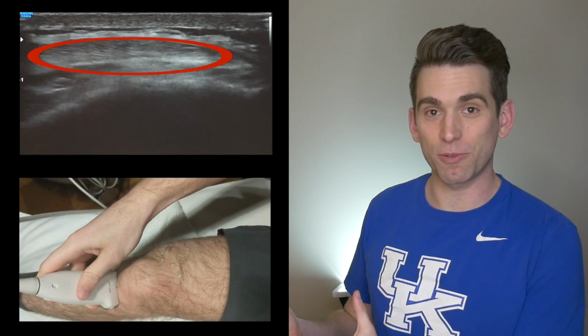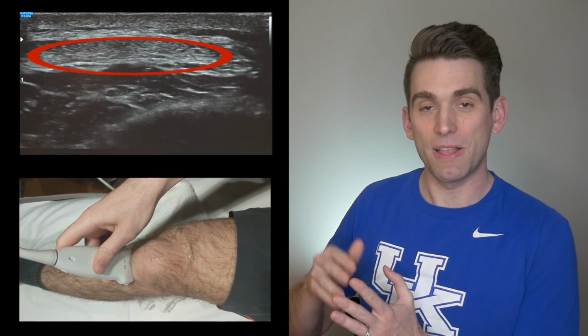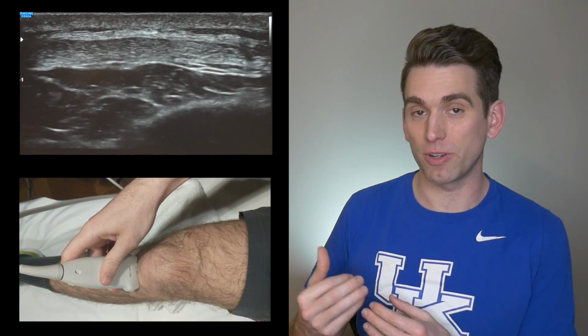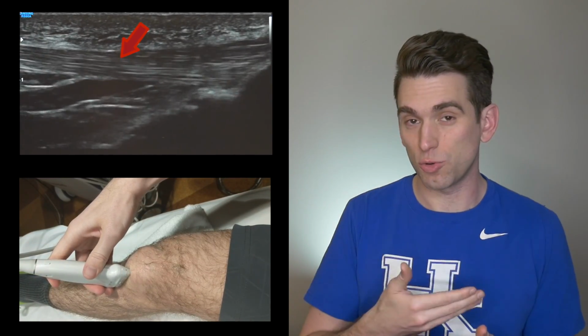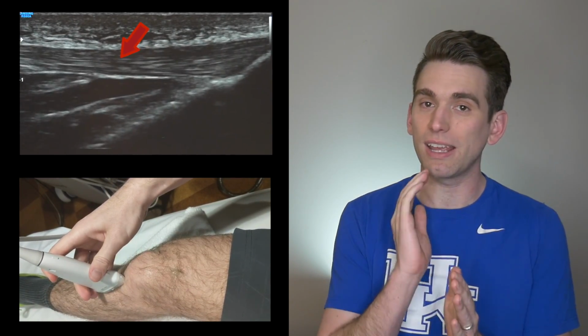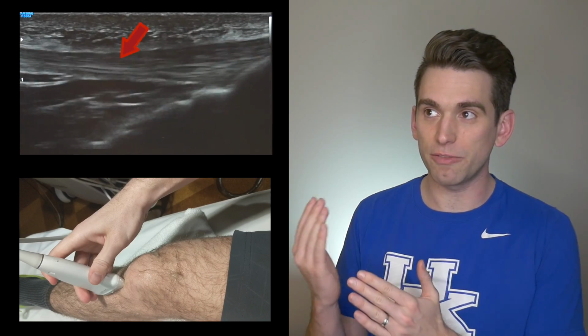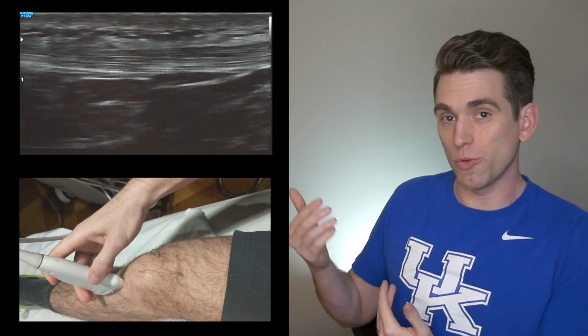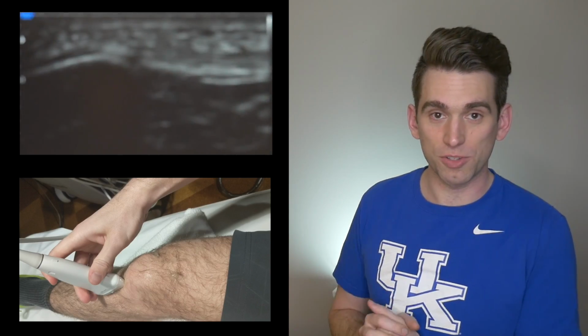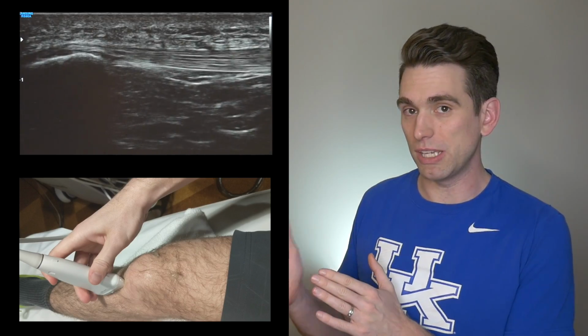This is a location of where you can see the ultrasound probe. And then on the screen, you can see what these different structures look like. So we can look at it cutting across in short axis, as we say, or we can look at it lengthwise, and it has different appearances based on that orientation. But this is what a healthy, normal patellar tendon looks like under ultrasound, and this is what those doctors are seeing when they do this procedure.